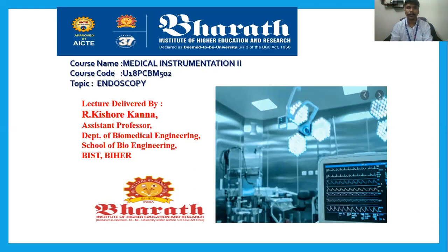Endoscopy helps doctors and physicians view the internal sections of the human body without any cut or coagulation. That is the major and ultimate function of endoscopy.